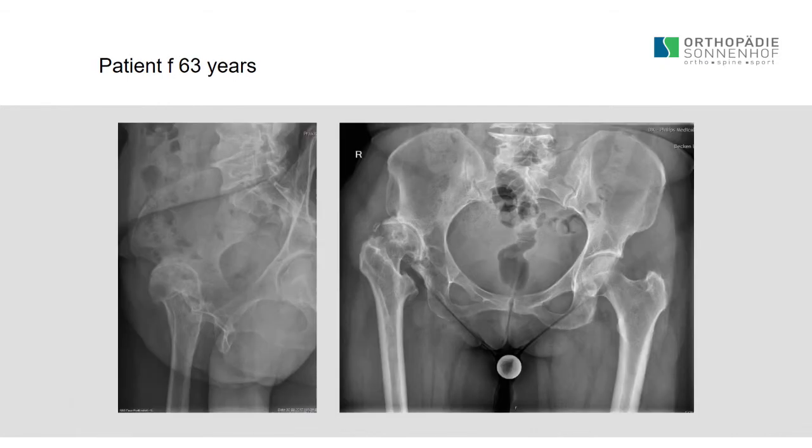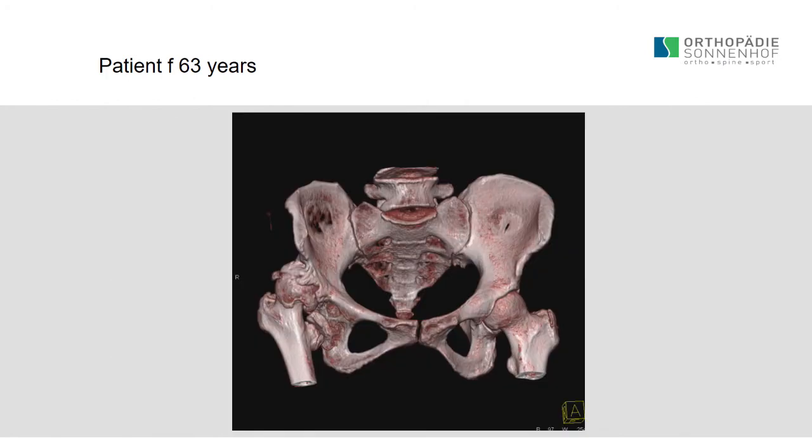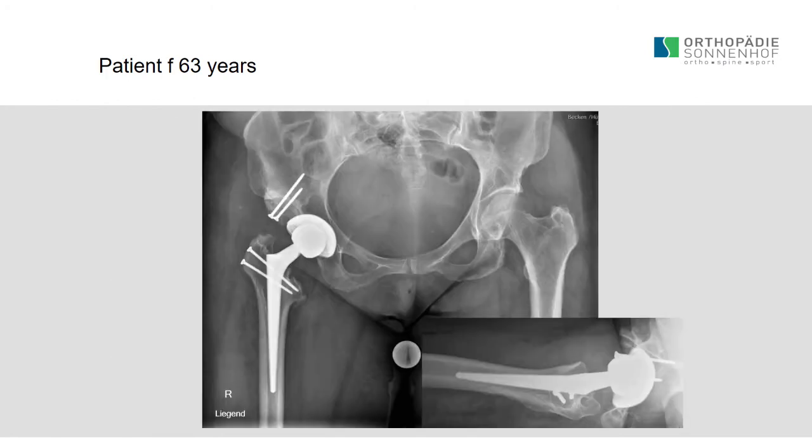This is much easier. In this case, we did also a trochanteric osteotomy, but it was also not a case for a short stem, because the area of the calcar is almost completely missing, so you need a conical stem to adapt for the high antetorsion and for the missing calcar region.